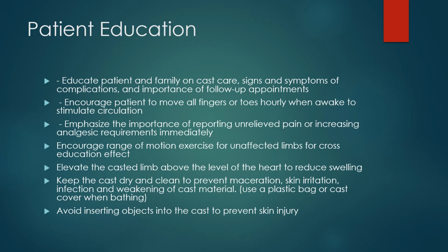And then the last point is you should avoid inserting objects into the cast to prevent skin injury, because that place is covered. An injury can occur, you might not feel it, and then it will be there and predispose you to infection, which will be a complication that will be detected not early but at a later part.